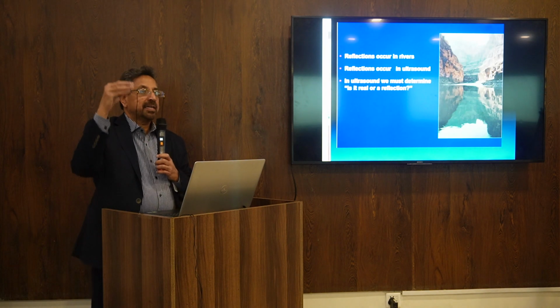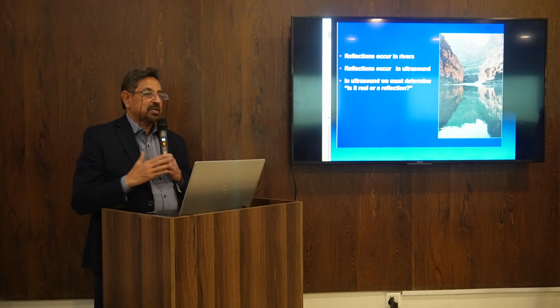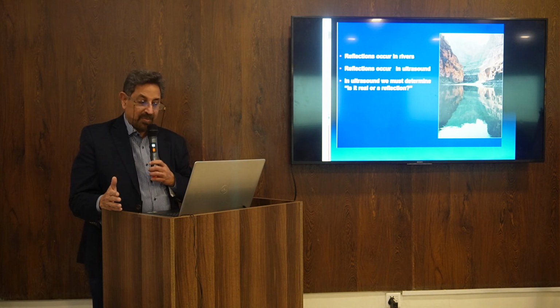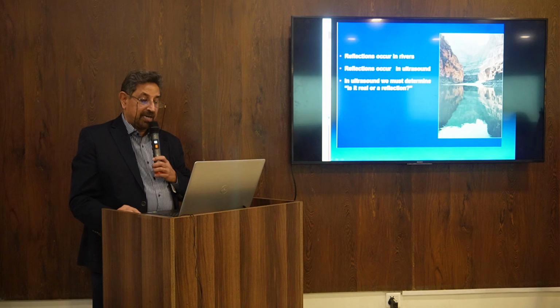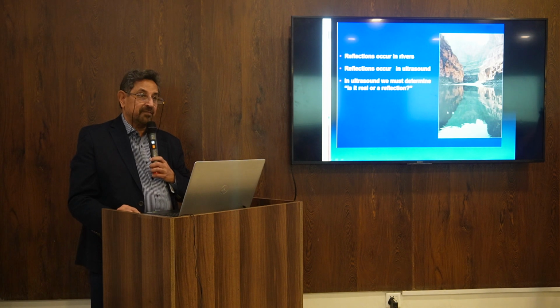The shadowing is an artifact. From calcium plaque, there is shadowing. If artifacts are not there, we can't diagnose the shadowing. In the same manner, reflections are there, which is the basis of ultrasound, right? You see the reflected images over there. This is not real, this is a reflection.